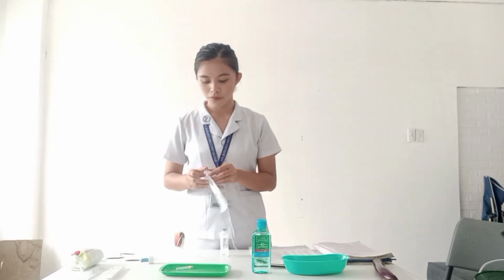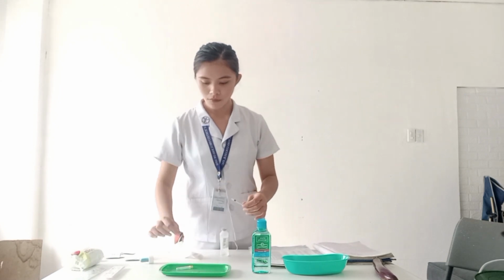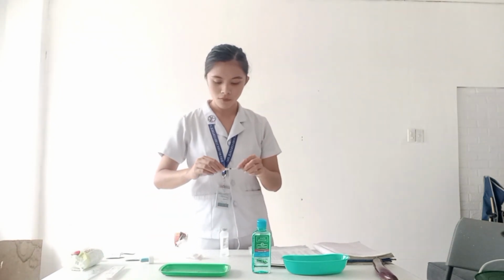Now I have to attach a filter needle to draw up a premixed liquid medication from a multi-dose vial. Ensure that the needle is firmly attached to the syringe, because a loose attachment of the needle will not draw the medication properly. Now I have to remove the cap of the needle, then draw up into the syringe the amount of air equal to the volume of the medication to be drawn.